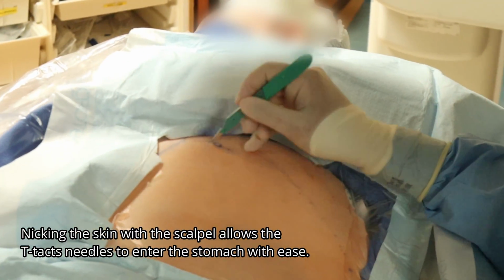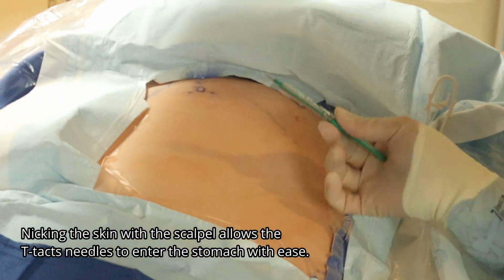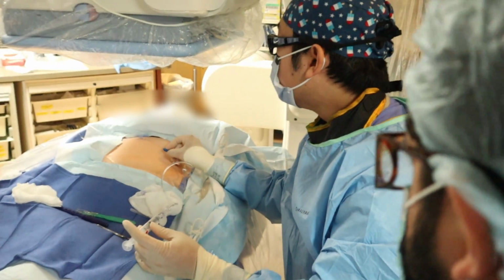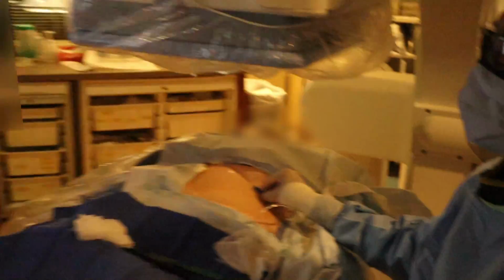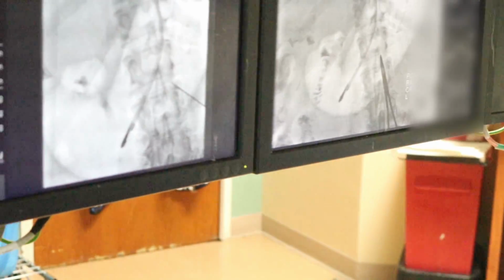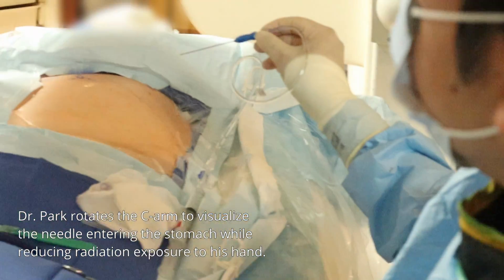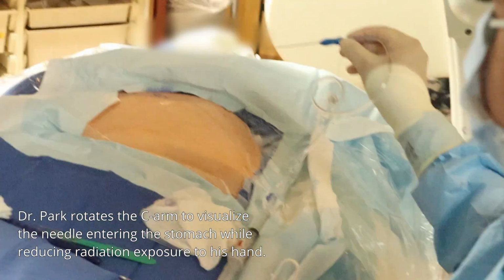T-tack access site. We're going to make sure that this is over the stomach on AP first, right? So we're going to put that over AP. So we're on the stomach, right? Some people do this advancement under lateral. I like to do a little bit of RAO to get my hand out of the way. So about 15 to 20 degrees.